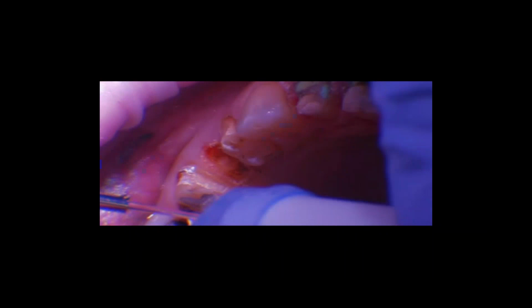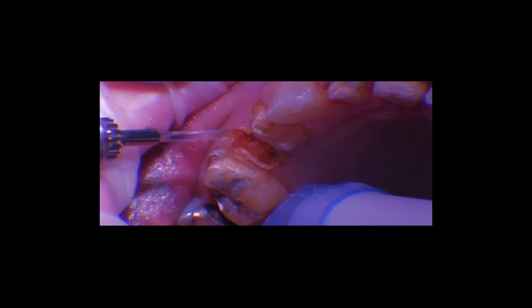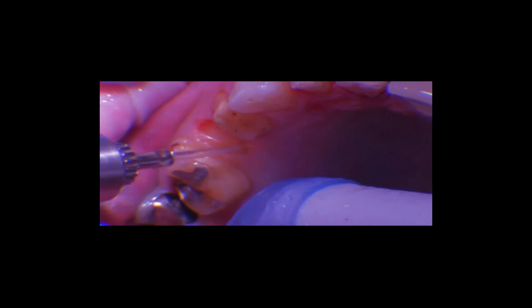And if you're using the tipped handpiece, you can use that conical sapphire to do that. And then once you go 2-3 millimeters deep, however deep you want to, then remove the tissue with a chisel tip. Or what I do now with the tipless handpiece, it works so well, is I do everything with the tipless. So I'll just cut my outline with the tipless handpiece, and then just go ahead and sculpt out that tissue using nothing but the tipless.